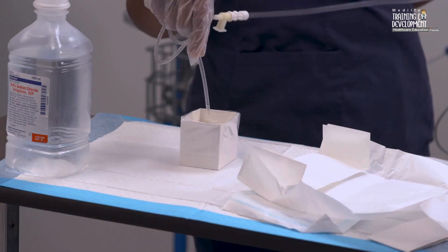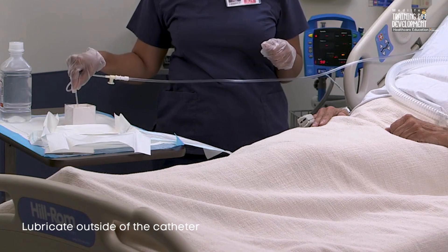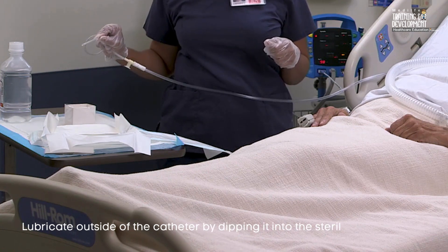Using your dominant sterile hand, lubricate the outside of the catheter by dipping it into the sterile solution to ease insertion of the catheter into the tracheostomy tube.